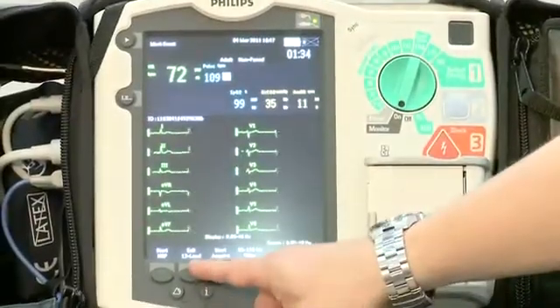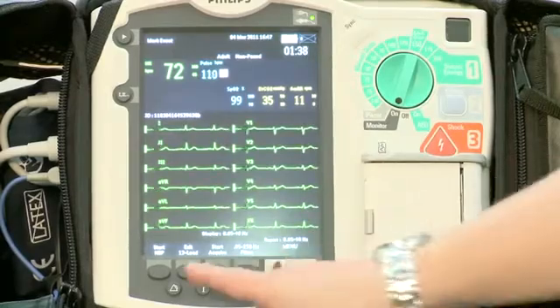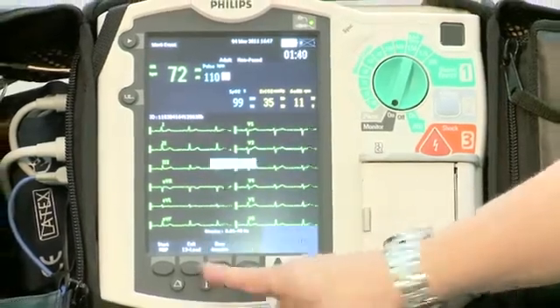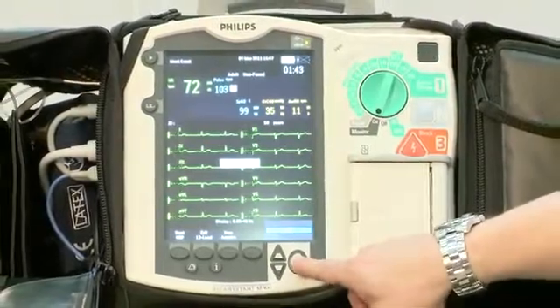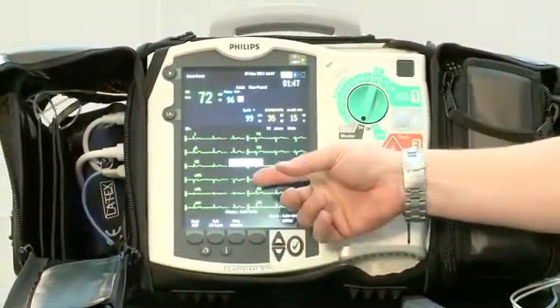We're able to simply start acquiring the 12-lead by pushing start acquire — age specific, dialing in the age and the gender. And in a few short seconds, the MRX device will premiere a diagnostic statement.